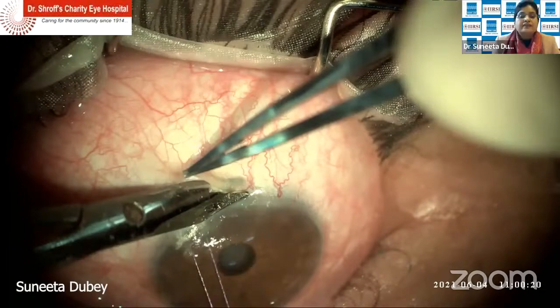Okay, so now I think, can we move, Dr. Arun? Yeah. Just one thing more. Some people leave a sort of conjunctiva, a skirt on the corneal side, and that makes stitching a little easier. They don't have to tie with the cornea and they can stitch the conjunctiva. They get good exposure also.